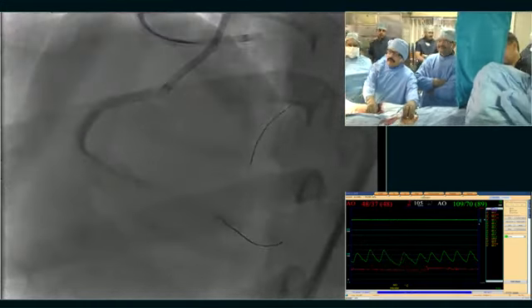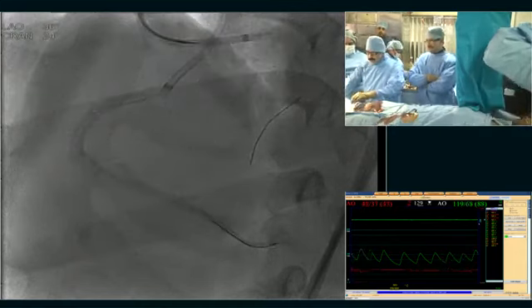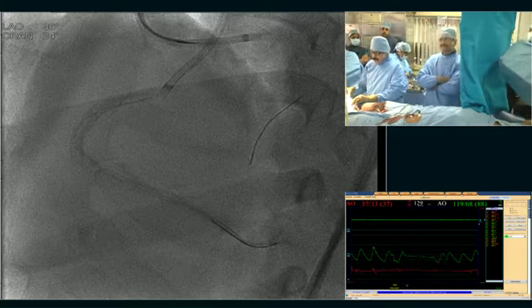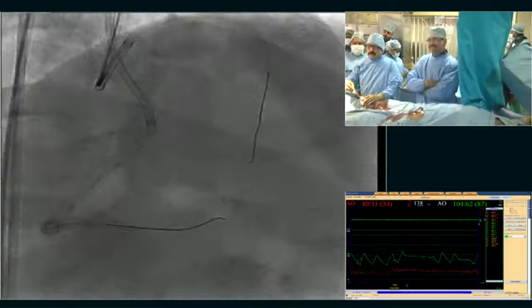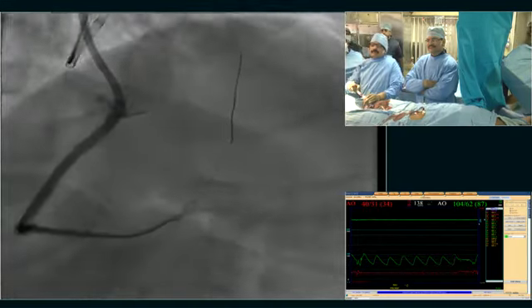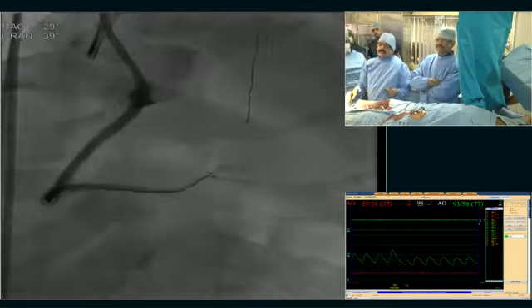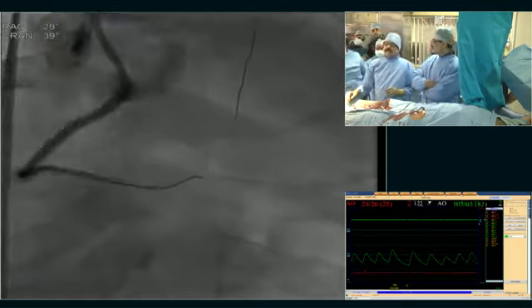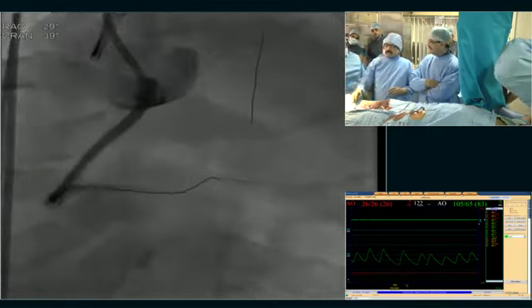Which double lumen microcatheter will you use now? We are using Crusade only. We have Sasuke also available, but right in the lab we use Crusade. So for the PD, as you said, we'll go for the Crusade. PLV also with the Crusade.